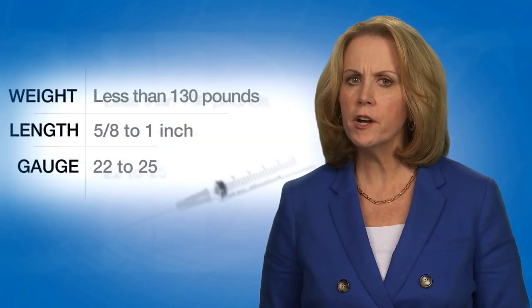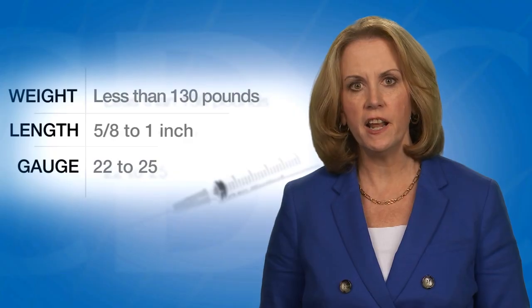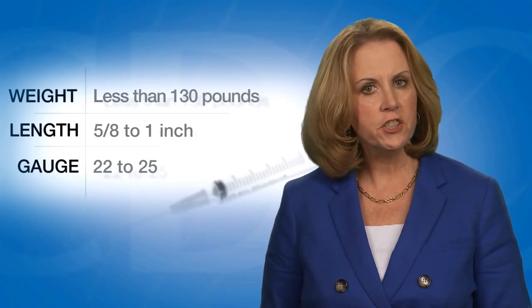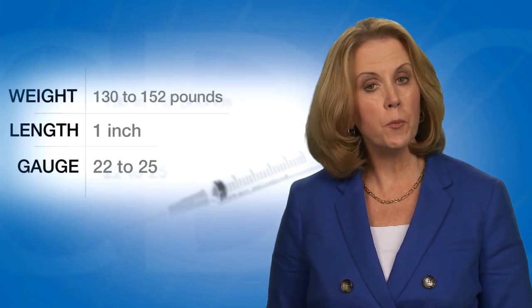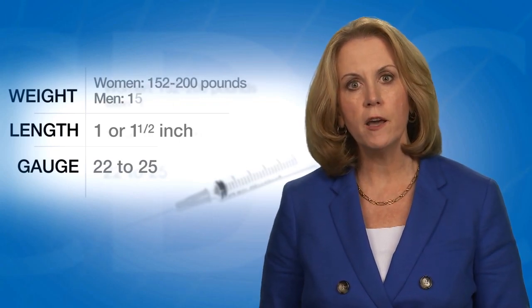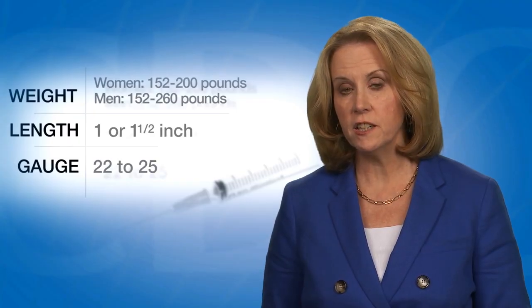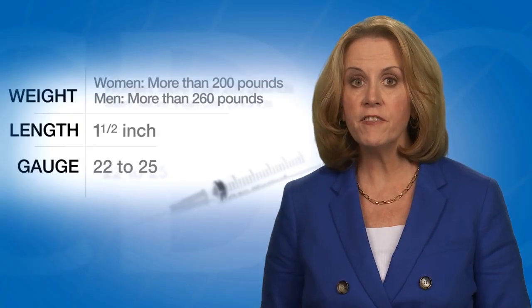For men and women who weigh less than 130 pounds, a 5/8 to 1 inch needle can be used if the injection is given in the deltoid muscle at a 90 degree angle with the skin spread taut; the tissue should not be bunched. For men and women who weigh 130 to 152 pounds, a 1 inch needle should be used. For women who weigh 152 through 200 pounds and men who weigh 152 through 260 pounds, a 1 or 1½ inch needle is recommended. For women who weigh more than 200 pounds or men who weigh more than 260 pounds, a 1½ inch needle is recommended.